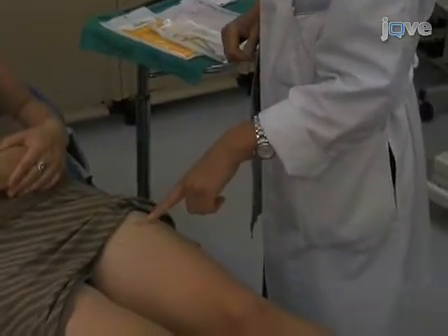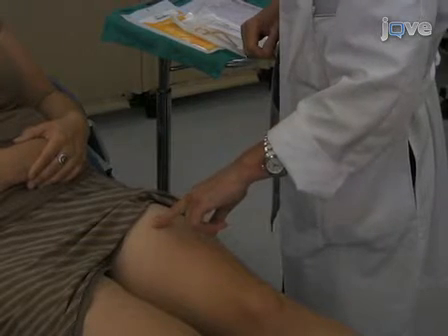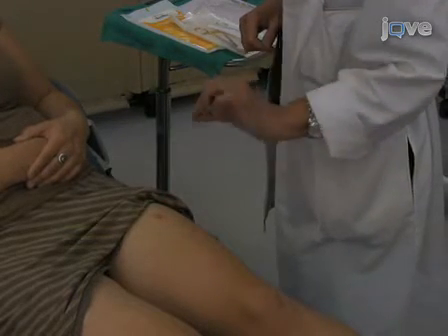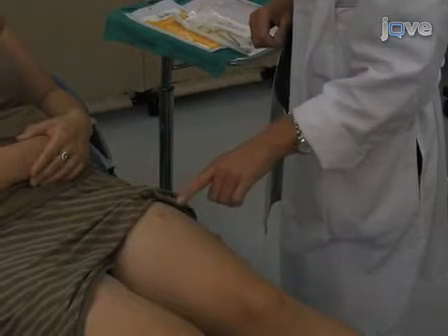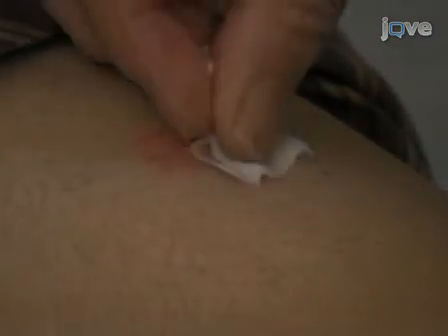Prior to catheter placement, the area from which samples are collected must be defined. When sampling from an artificially created inflamed area, such as an experimentally induced sunburn, plan on inserting the catheter at the edge of the sunburn. Clean a small area at opposite edges of the lesion or site you intend to collect your sample from with alcohol swabs. These cleaned areas will be the intended insertion and exit points for the catheter.